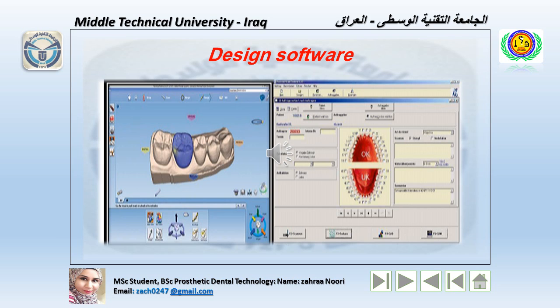However, the general forms of tooth morphology provided by this CAD/CAM system can provide only basic shapes. There is always some manual alteration and modification required because every patient is unique and every tooth has its own morphological features that are unique for the patient.